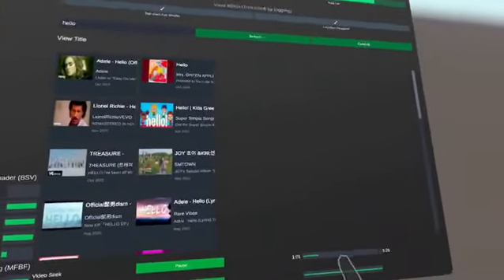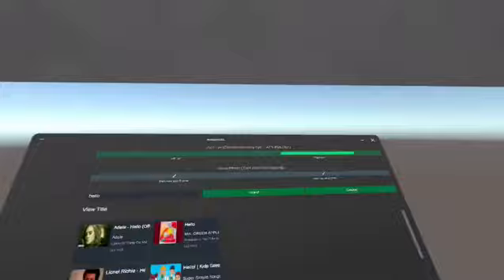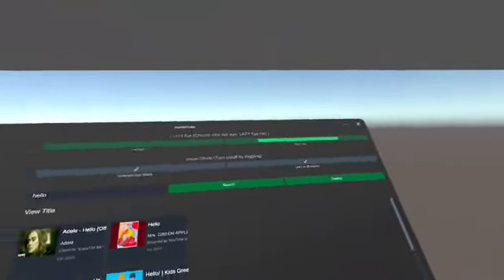You can mute or unmute the videos. You can pause, play the videos. And here you can seek the videos. It just works like YouTube, but it is specially designed for people with lazy eye syndrome. So this is all about it.